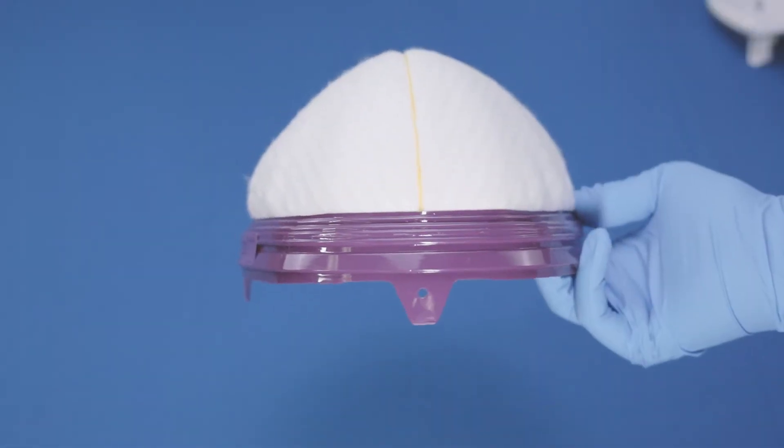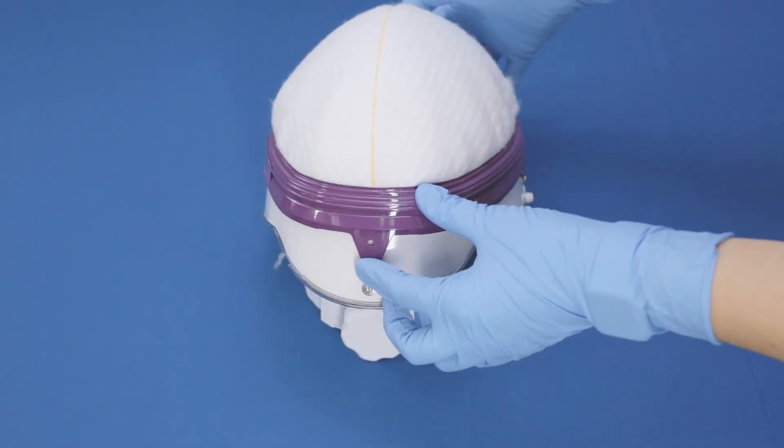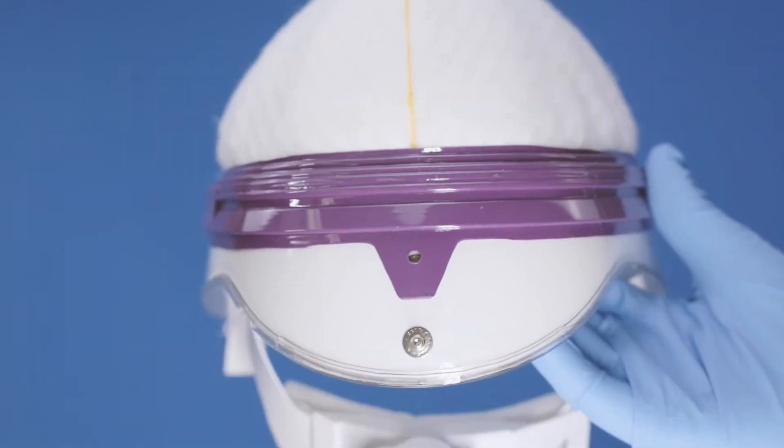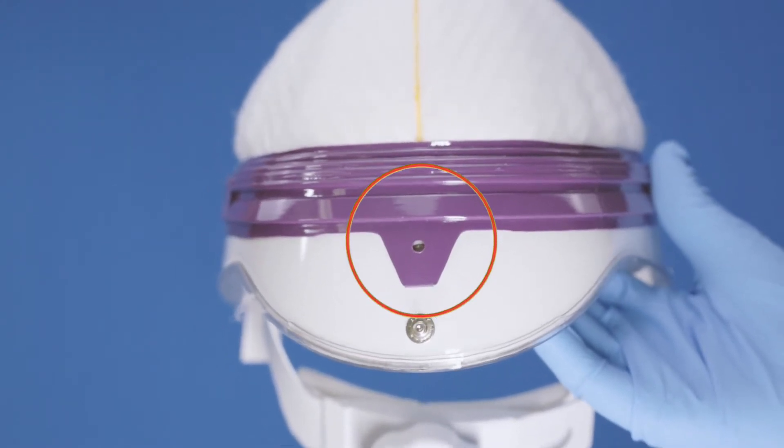Begin filter cartridge assembly by grasping the magenta retainer ring and lowering the cartridge down onto the top of the helmet. Position the rear cartridge snap tab at the rear of the helmet with the snap tab hole over the top rear helmet snap.